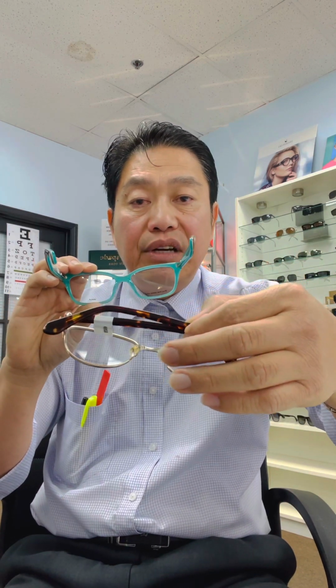Okay, compared to a plastic frame, the plastic frame doesn't have these nose pieces. So if you're buying a plastic frame, when you put it on your face, however it sits on your nose bridge, that's how it is. You cannot adjust it. But this one though, we can modify. We can modify the saddle bridge. We can put nose pieces in here. We just have to send it to the lab and they will put this small nose piece in here. Okay, so these are the parts of the frame.